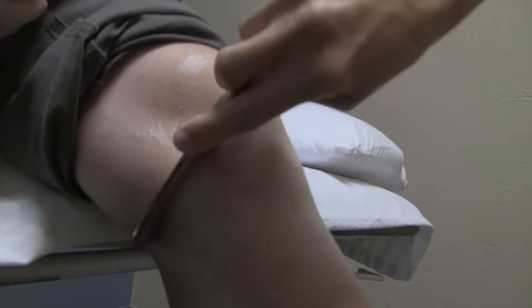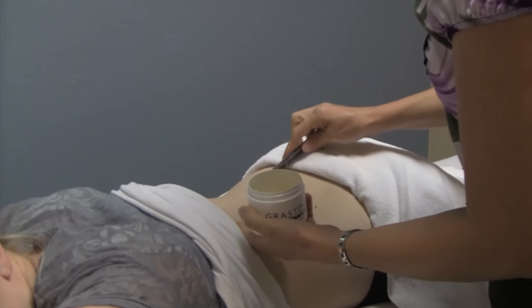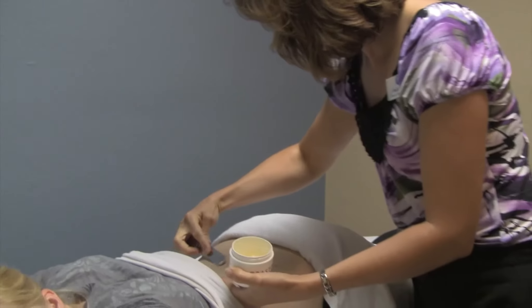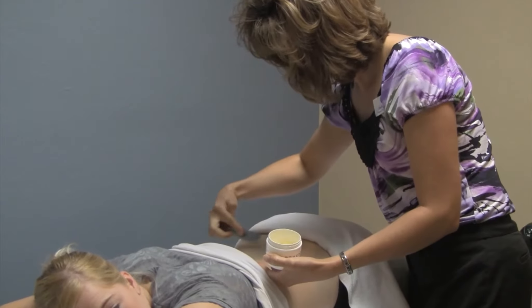The Graston Technique is a treatment technique that effectively reduces the inflammation of the tissues, decreases pain, and increases mobility by decreasing the restrictions in the myofascial tissue.